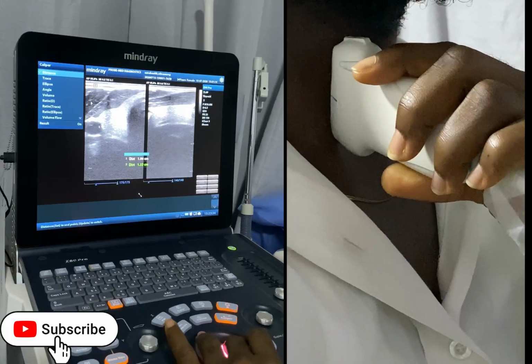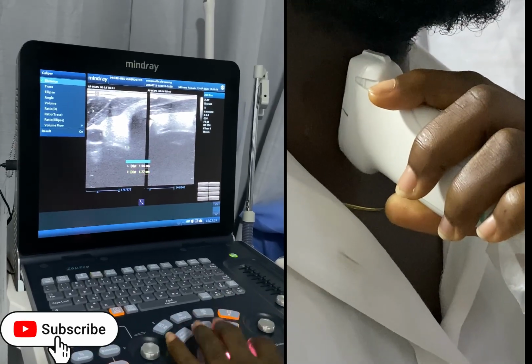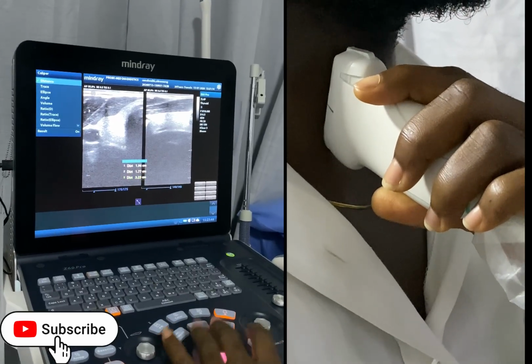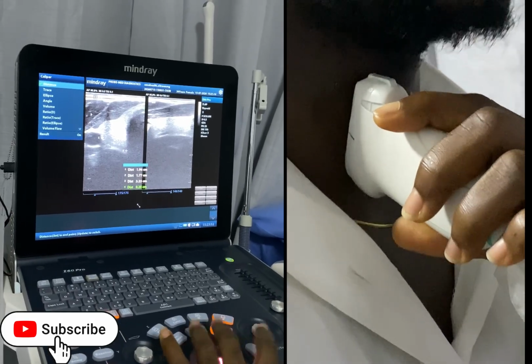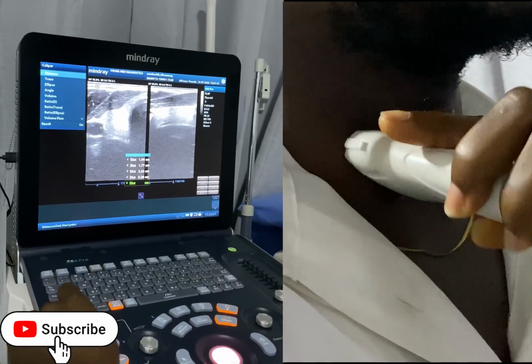So try and then measure. Let's see. You can do it. You can use your own self to do the thyroid assessment as well. As you can see, I use my own self to do this examination or this video for you.